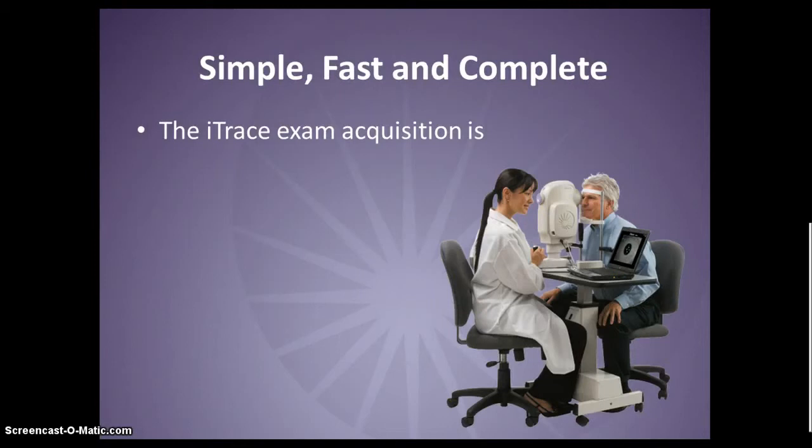With the purchase of an iTrace, you get a full-day training and installation with a certified Tracy training expert. Within only a few hours, your technicians will learn how easy it is to acquire exams. They'll understand how fast exam acquisition can be, and that'll, of course, benefit your patient workflow. You and your technicians will realize the complete and abundant information available from this quick and easy exam. Let's take a look at an actual patient so you can see just how easy the process can be.